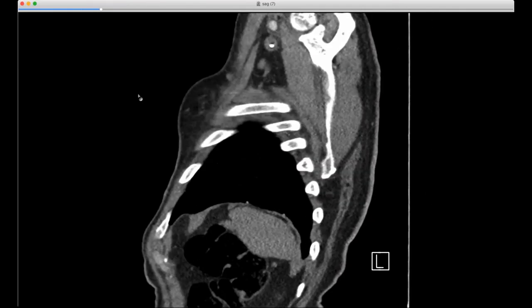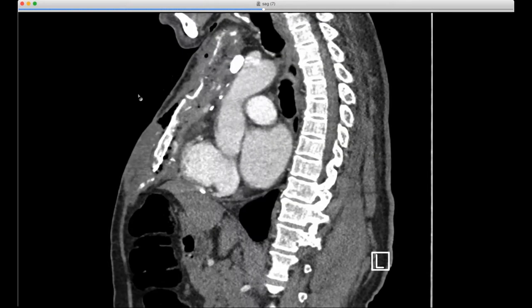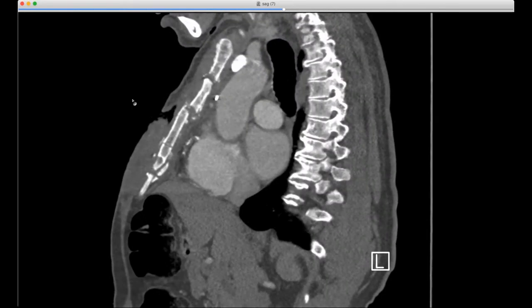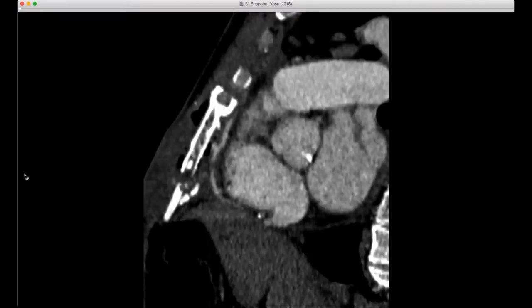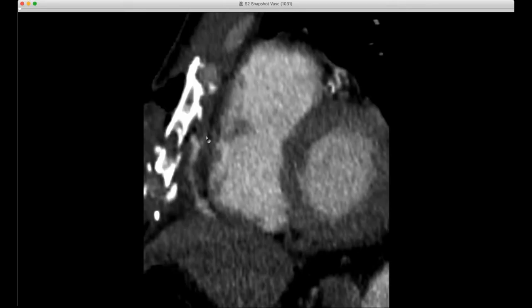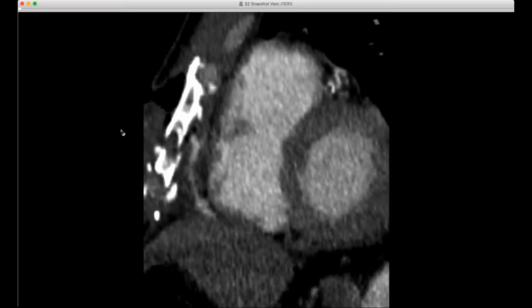Here's the sagittal view. At this point everyone was gathering around the screen. You can see the native vessel and here's the venous bypass graft — right at that point, that's a little pseudoaneurysm that I told them about. They went back in; I gave them some reformats looking at the pseudoaneurysm. They did selective angiography and found an area of active extravasation at the mid-graft and placed a covered stent over that. The additional history I had to dig for was that they did an exploration of the mediastinum after that first CT, found a small area bleeding presumably within the graft, and thought they had repaired that. Obviously something went wrong.